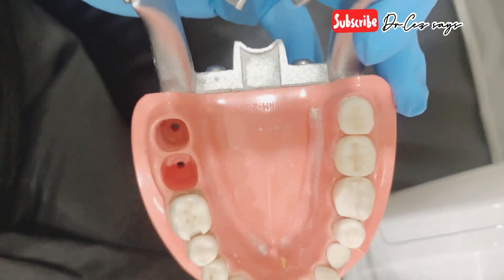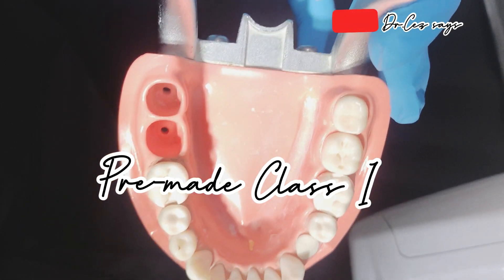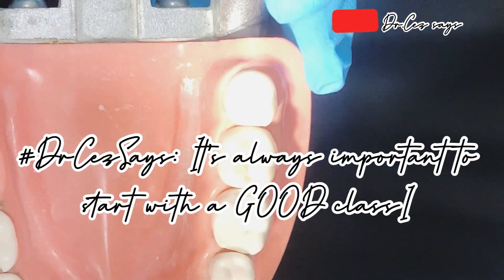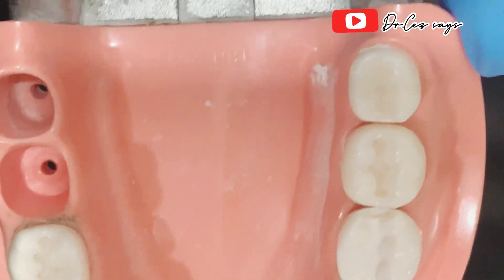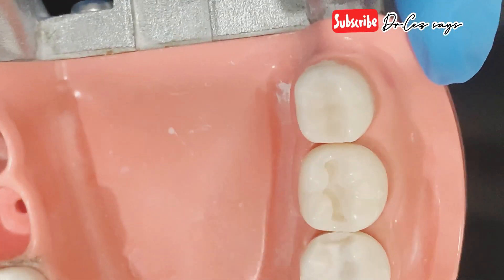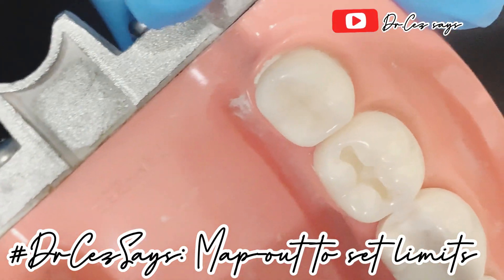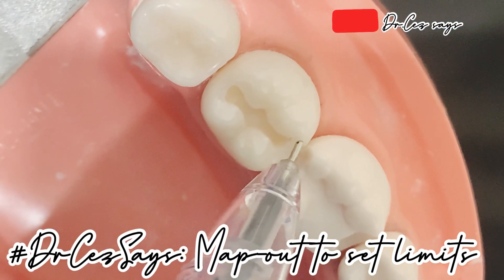What we have here is a Class 1 preparation — I'll just zoom it in. So this is a Class 1 preparation. For your Class 1 prep, after doing it, you first check your contact area. In this tooth it's already prepared. In order for us to see the contact area, you have to mark it like this.